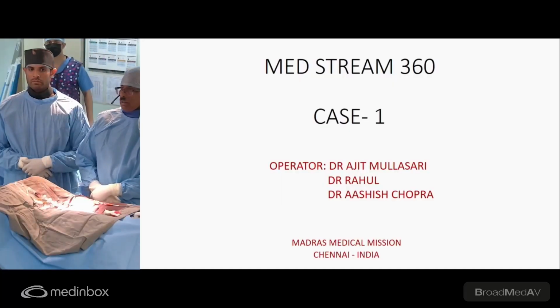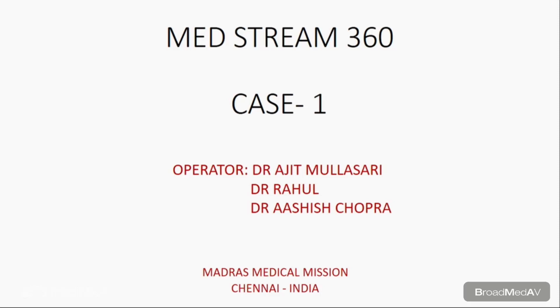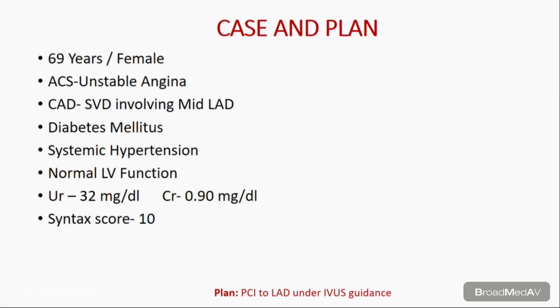Good morning and welcome to the transmission. Let me discuss the case. It's a 69-year-old female presented with unstable angina, for which an angiogram was done, which showed single vessel disease involving the mid LAD. Associated comorbidities are diabetes and systemic hypertension. Routine echocardiogram showed normal LV function, baseline creatinine 0.9 milligrams per deciliter, and the SYNTAX score is 10. Hence we decided to go ahead with PTCA to LAD with imaging guidance.